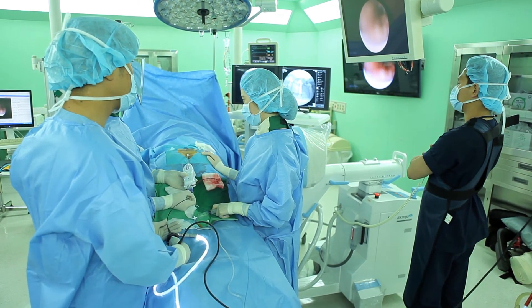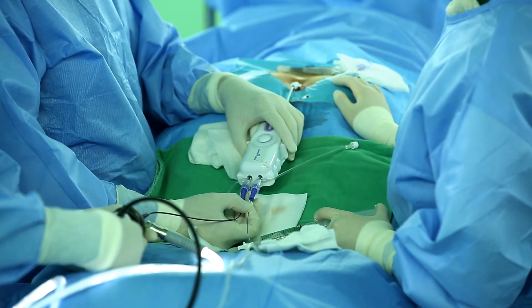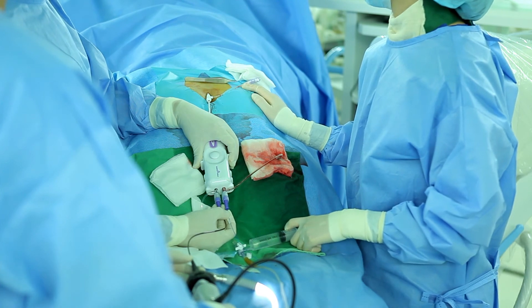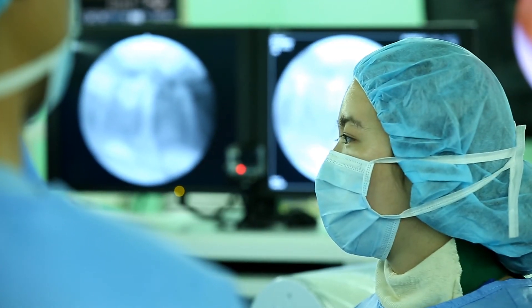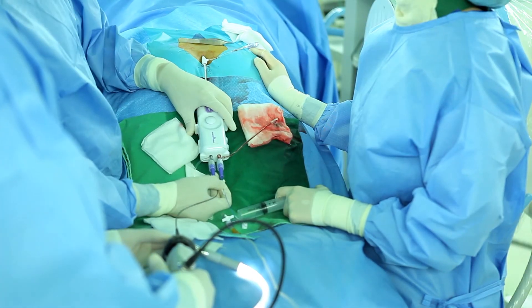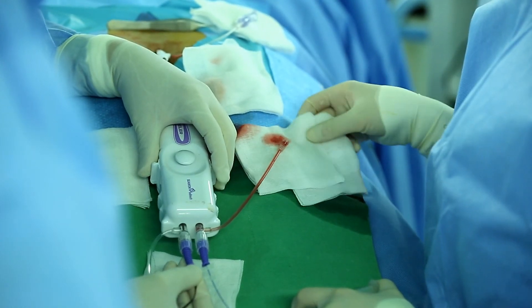While you are in laser treatment, keep injecting saline to see clearly. However, if the patient appeals severe pain and wants to stop the procedure, be aware that SELD needs more or less 200 cc of saline, but it may exceed 500 cc when doing multi-levels. Use the minimum saline necessary to maintain a proper level of view and cool down the heat from laser ablation, which may damage the nerve. Push 1 to 2 cc of saline intermittently when checking for an unclean view due to bleeding or disc particles, and push 5 cc of saline for adhesion lysis to facilitate catheter advancement. If the patient complains of neck pain during SELD, most likely the cause is increased epidural pressure — stop the operation for a while, remove the cap of the drain tube, place the patient in heads-up and legs-down position, and after the pain is gone, you may continue SELD.